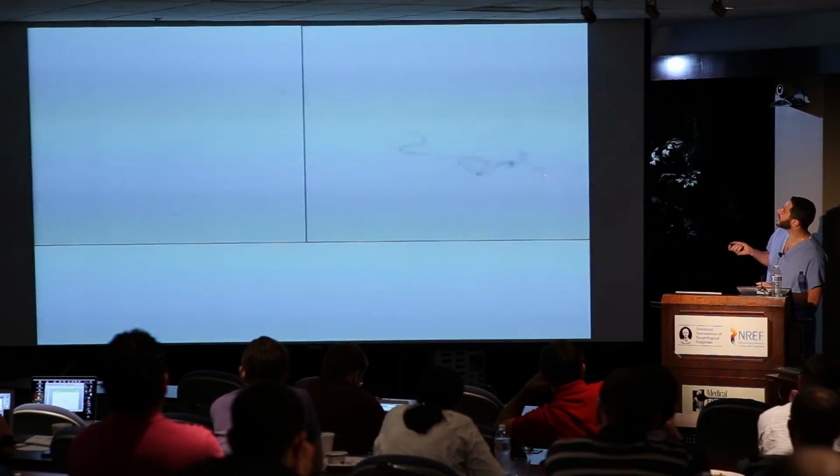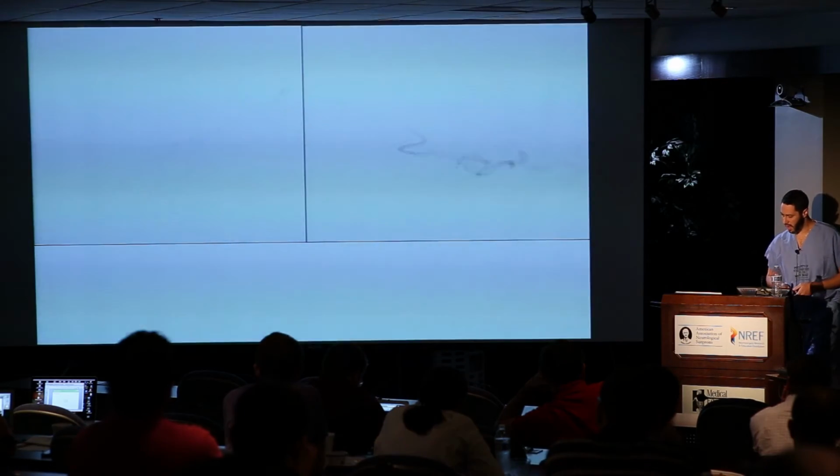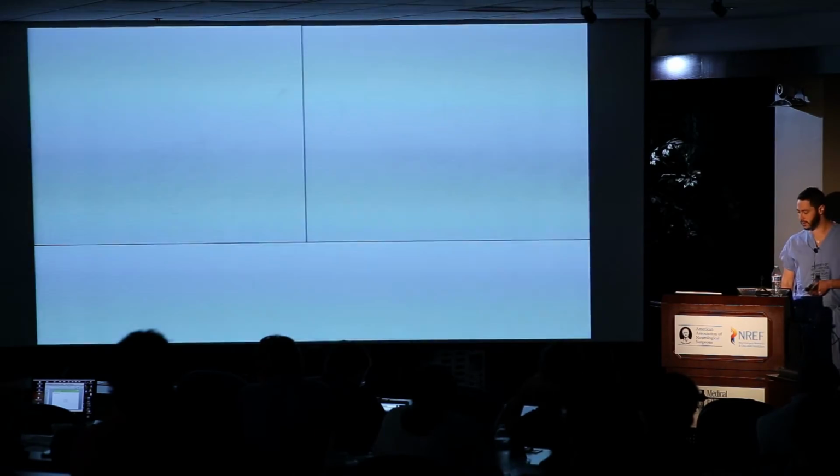Watch this. Can we turn the lights down a little bit? I don't know if you guys can see that. But this was my point about injecting hard and refluxing back a branch. When I inject softly at the beginning of the injection, you see this, and then a little harder, and it comes back, and you see that secondary supply to the nidus. Actually, easier to drag it. You can see it come back. There you go. Doing force and contrast through the nidus there.